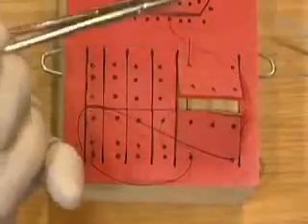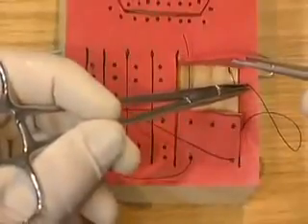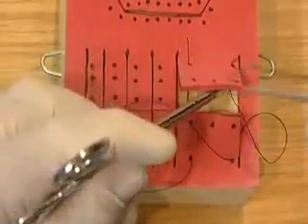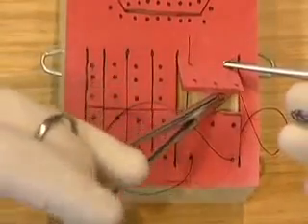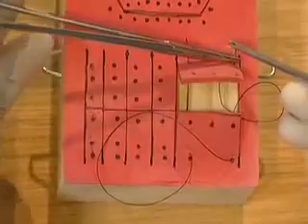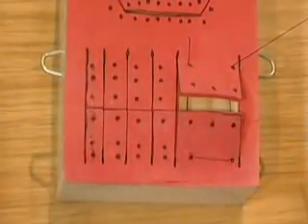Change over to the pen grip, lift the flap, going in at a distance, take the thread over, pick up by the end.